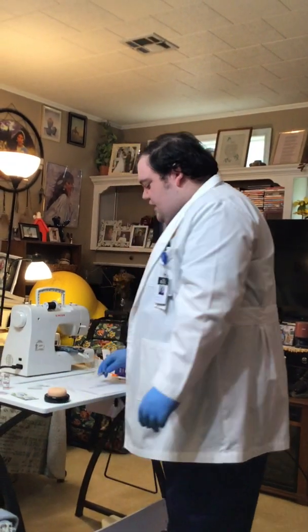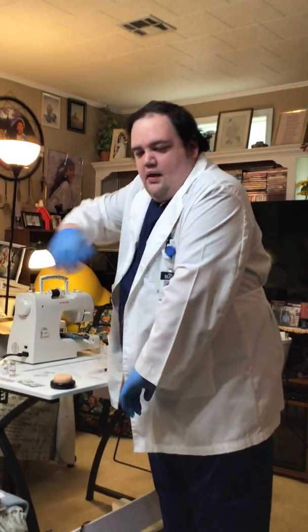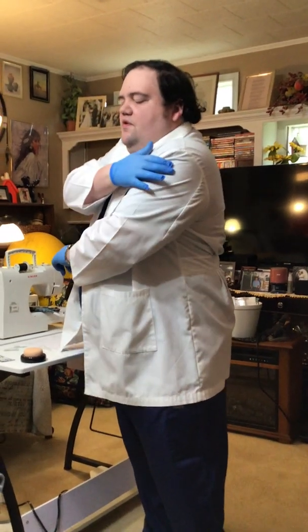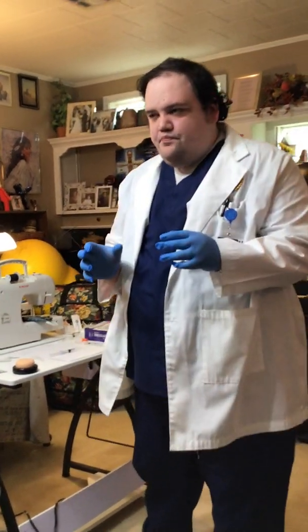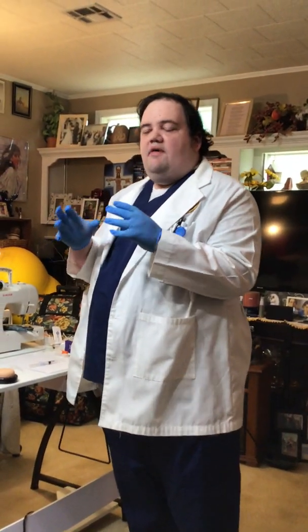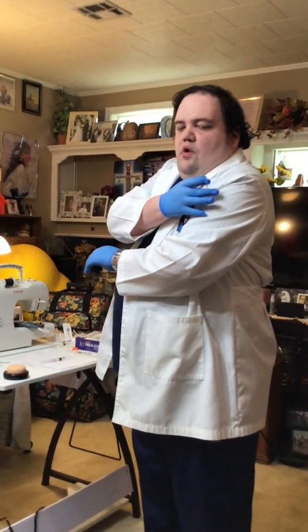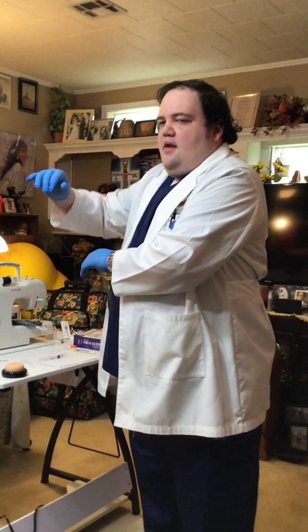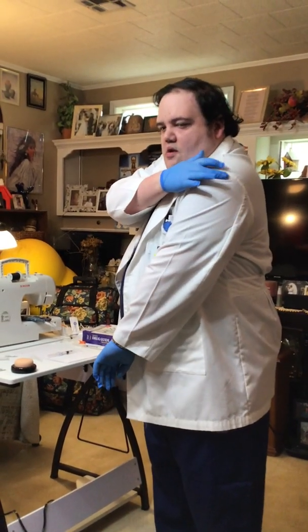Make him feel better. So we're going to administer this drug to the deltoid. The deltoid is this muscle right here at the top of the bicep. It looks like a Greek delta, and it covers this part of the arm. Men normally, in most cases, have a larger deltoid, so we can go a little bit more than women and children with injections.